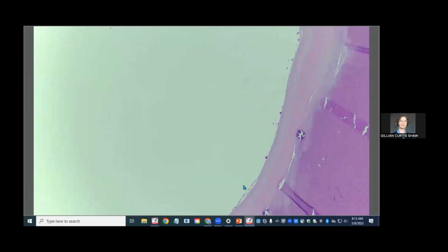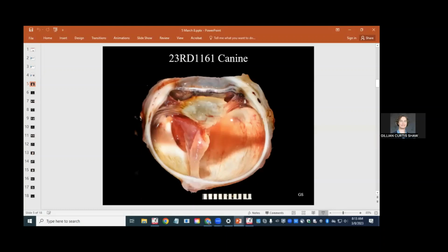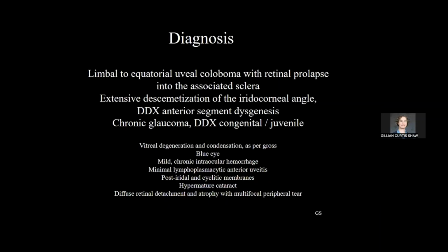If you pay attention to blue-eyed dogs in general, the choroid looks way, way thinner and less obvious than normal, even in dogs that don't have glaucoma or any other secondary lesions. So I think that it's part of being the blue eye plus glaucoma, and I think that's specifically a congenital type of thing. But it could be this eye was in the dog for a long time. If it hadn't developed glaucoma or perhaps complications of cataracts, it would just have been left alone. Yeah, much like the dog's other eye, they'll hopefully keep it in there in the head.